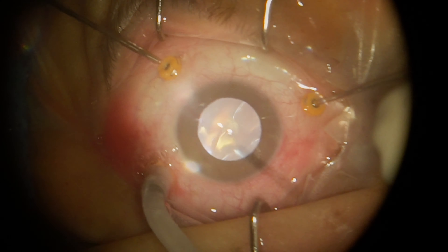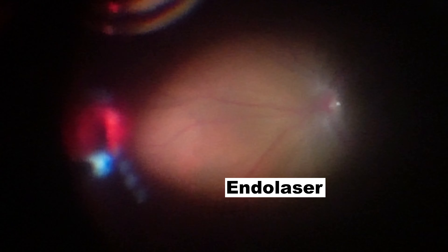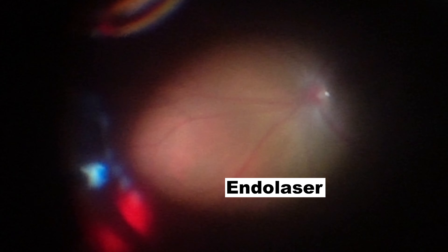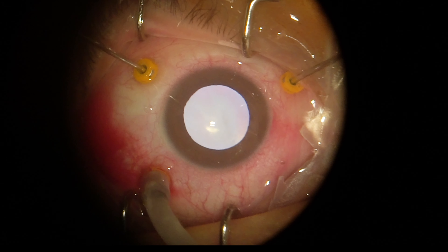I like injecting Perfluorocarbon (PFC) to make sure the retina will stay attached and stable. The laser has very good uptake now with PFC, and I do it peripherally as well.